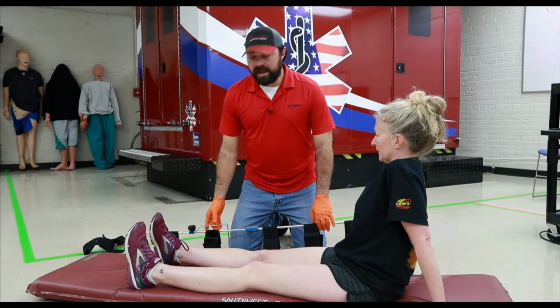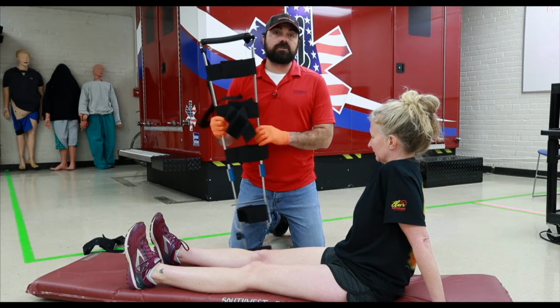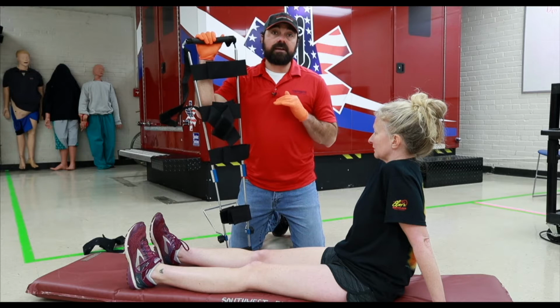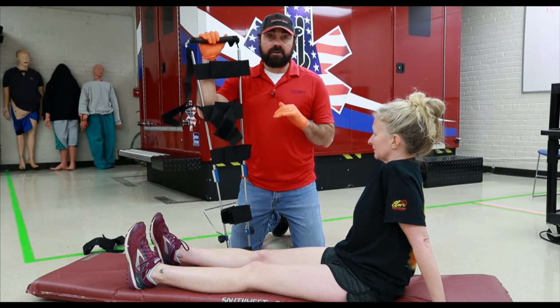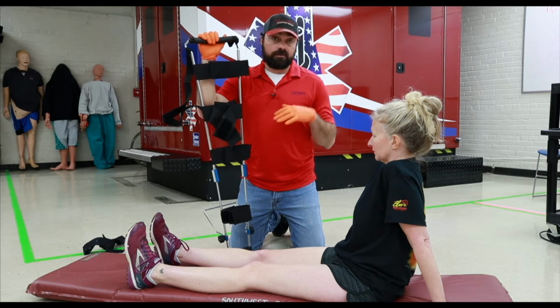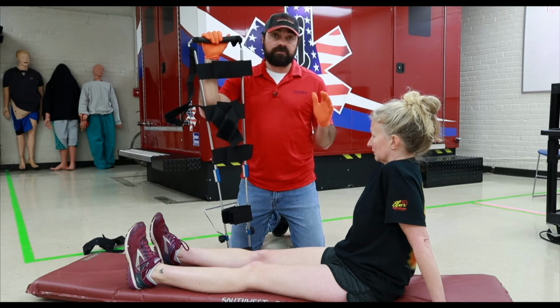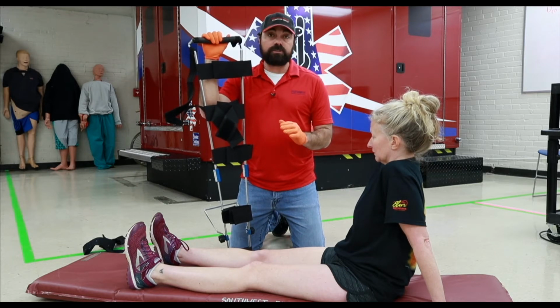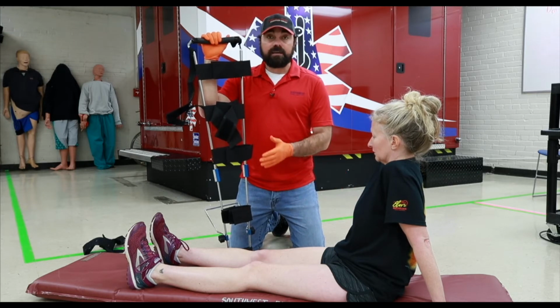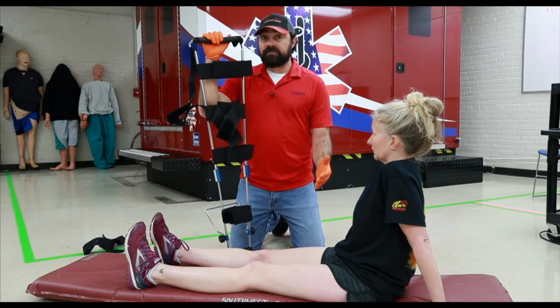All right, welcome back. It's time for the skill demo. We're going to be demoing the traction splint. So I'll tell you a little bit about the traction splint real quick. We only use the splint in the event of a mid-shaft femur fracture. No other injuries can be associated. It has to be a closed femur fracture. So basically, if the bone has come out of the skin, can't use it. So if it's a closed femur fracture, it has to be mid-shaft, according to what you can tell, and no other injuries. That means no injuries to the hip, the knee, the lower leg, the ankle, the foot on that extremity. So it's a very isolated injury.